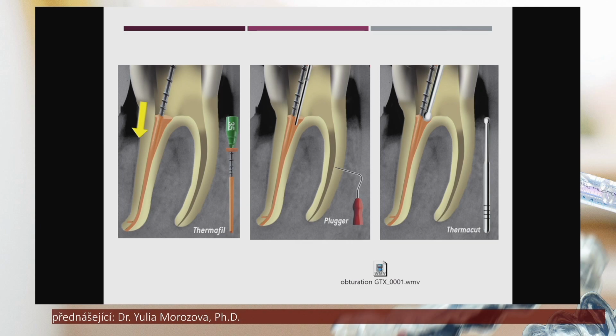Some authors recommend cutting a really short part of the tip to prevent overfill. When we have this obturator with a really small amount of sealer in the root canal, we just gently put it into the root canal until the rubber stop is on the working length.